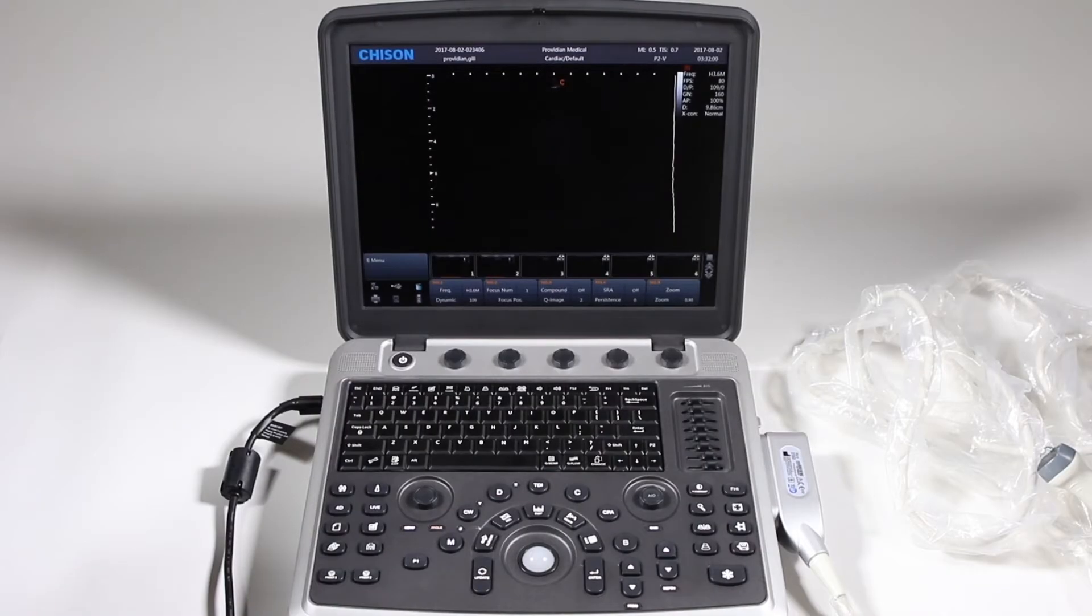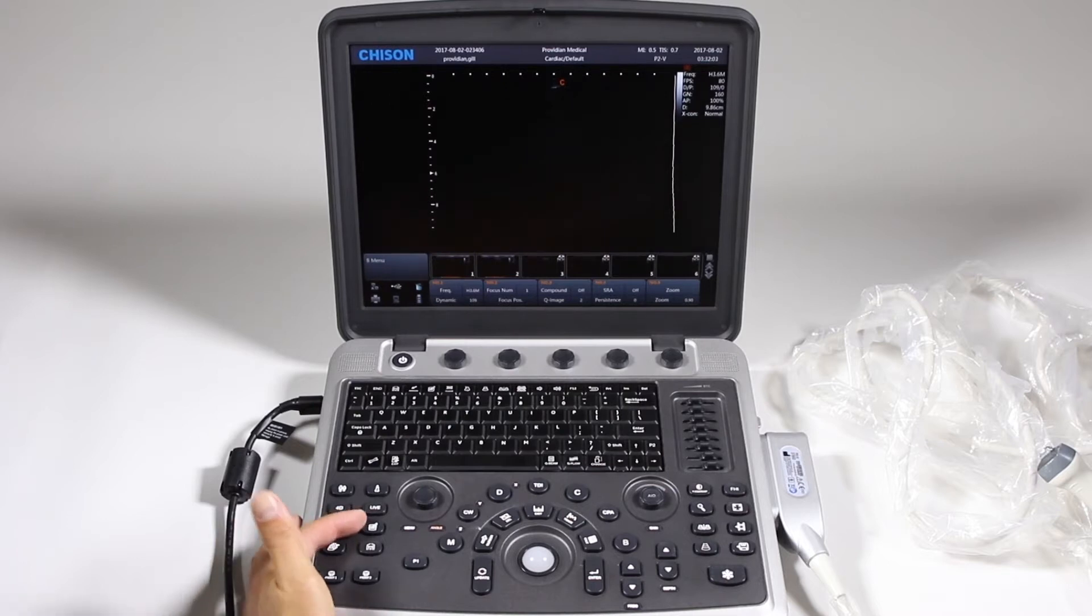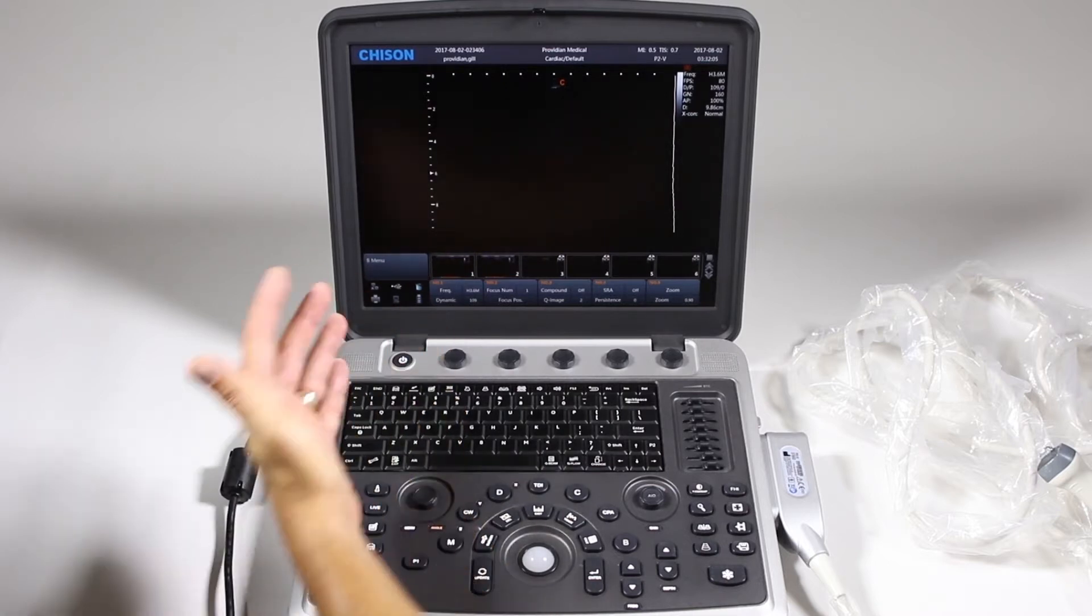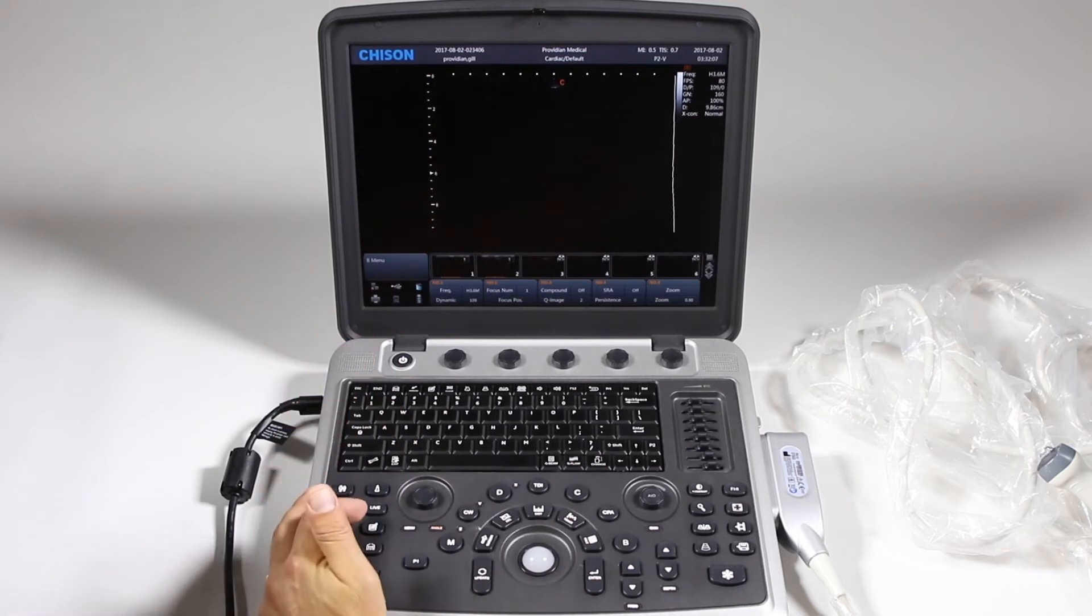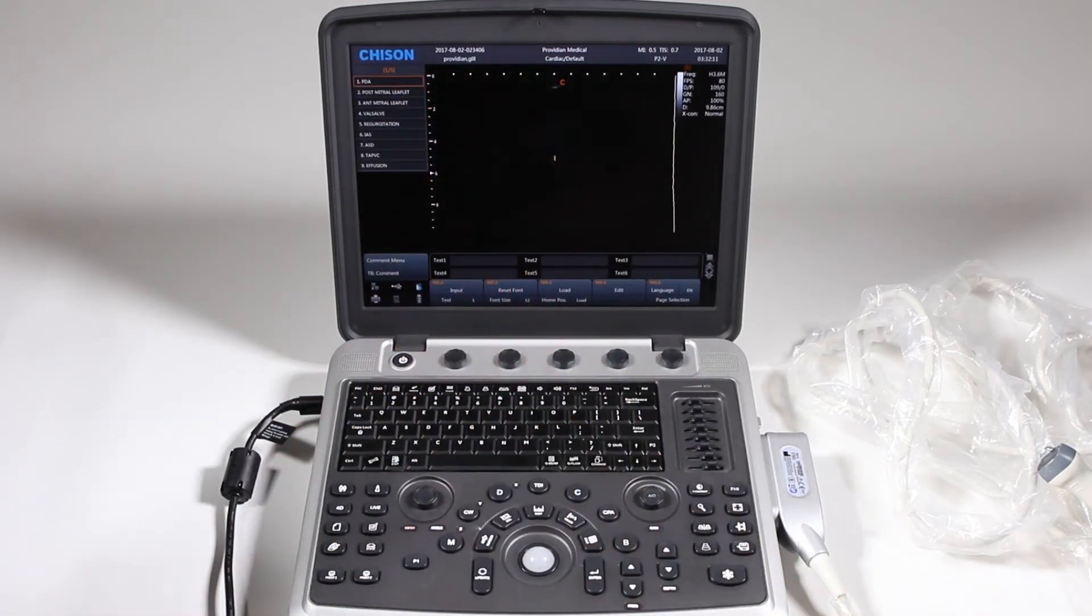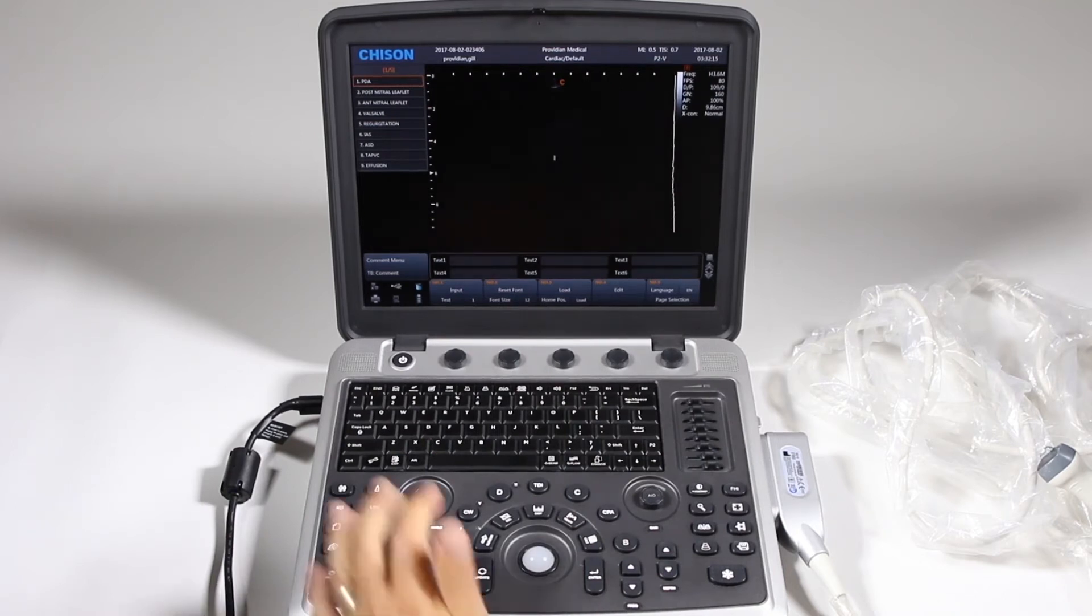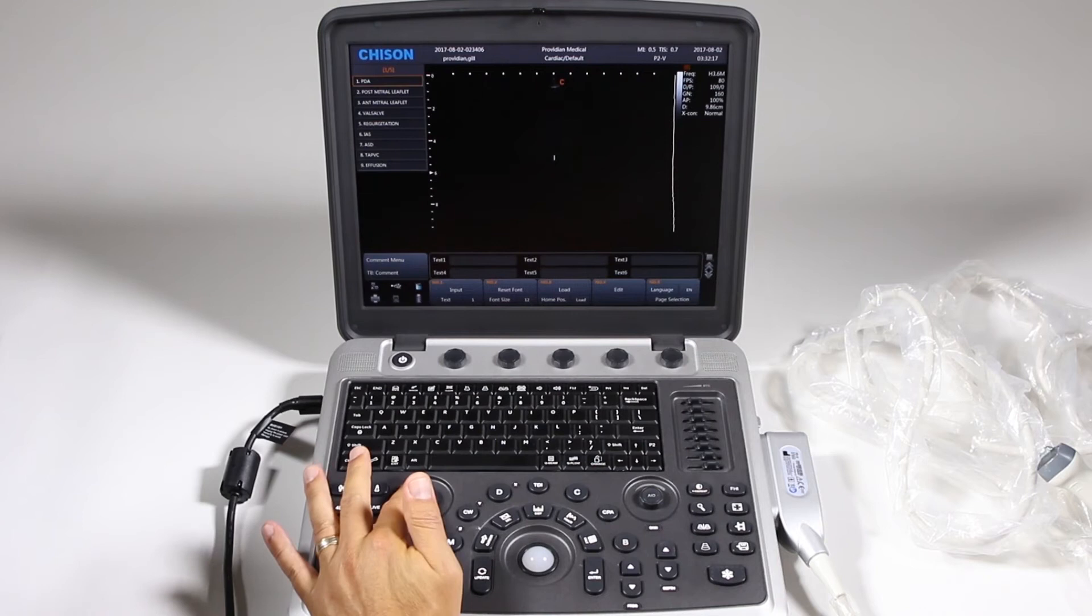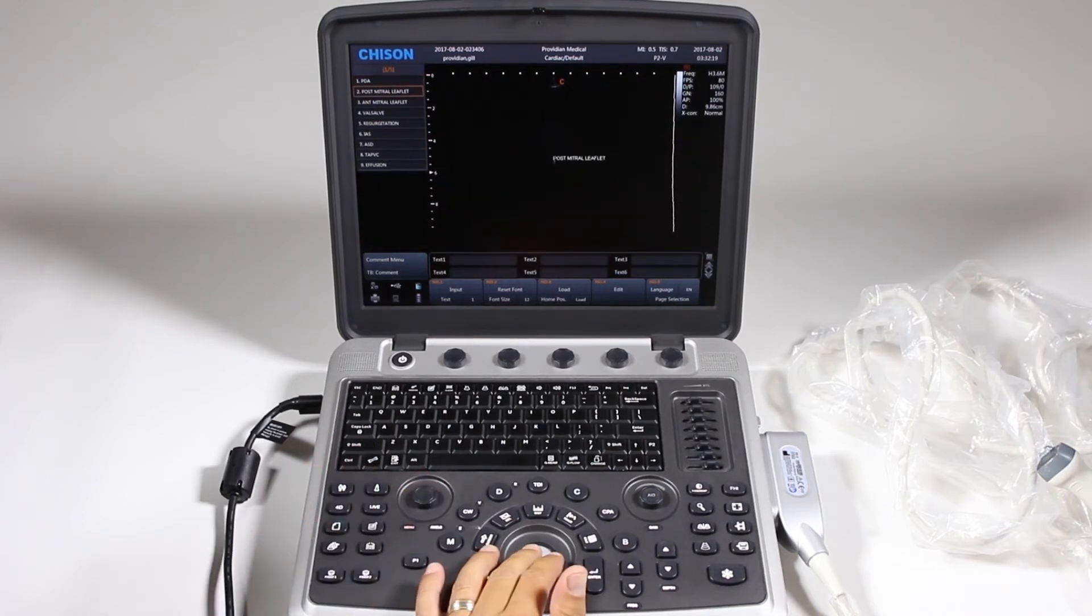For annotations and measurements, we'll start with the annotations. Simply press this comment button. It's the same button as up here if you prefer to use that. Go ahead and press here and you'll have an automatic list of auto text that will show up. You can choose from it by twisting this menu and pressing it down and it'll appear.